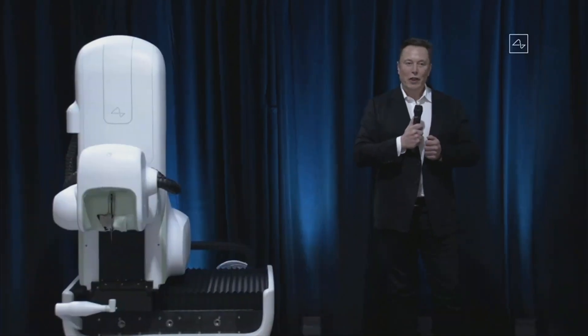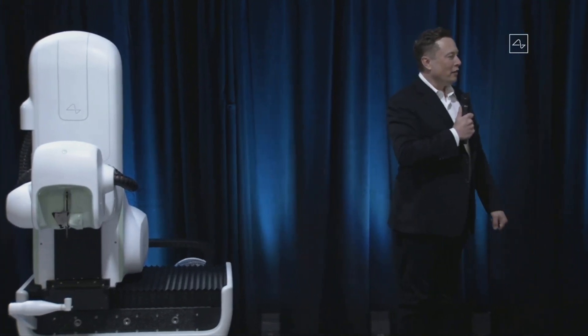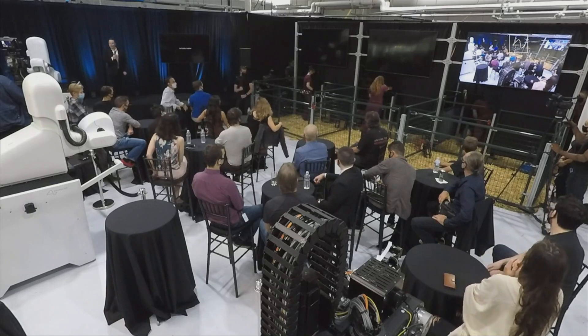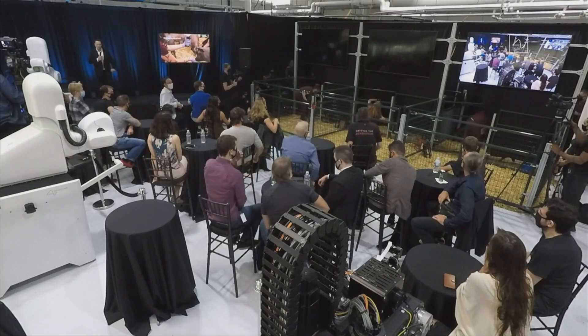What I'm excited to show you is the Three Little Pigs demo. We're bringing out the pigs, and what we're going to show you — I'll walk right over and show you.